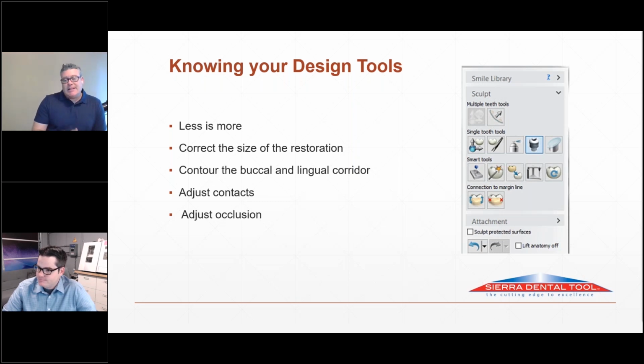I mean, we're going to talk about this later, but I get manuals and I just read them because so much is in the manual. The other thing is a lot of these softwares have this little question mark in the top in this picture. You click on that and it tells you what each one of these tools does. Spend some time learning these. It's important. And I think one of the good ways to look at the design process is to think about it as big to small. You do your positioning, you get it all done, and then you go in and do the tiny little movements. And if you think about it in that way, you just become more efficient at it.